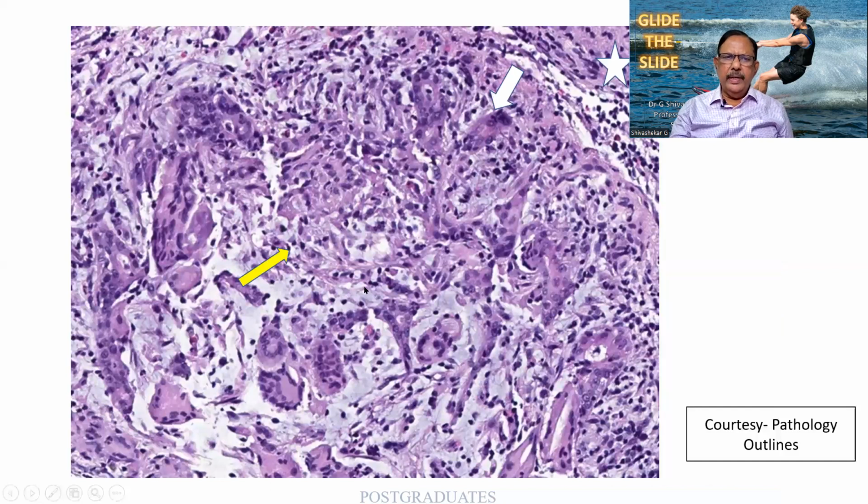Look at this picture again, it's the same. So I am finding a central granuloma composed of histiocytes and maybe even epithelioid-like cells. And I'm able to see a good number of these dark cells, the lymphocytes, in the periphery. The white arrow points out to a giant cell.